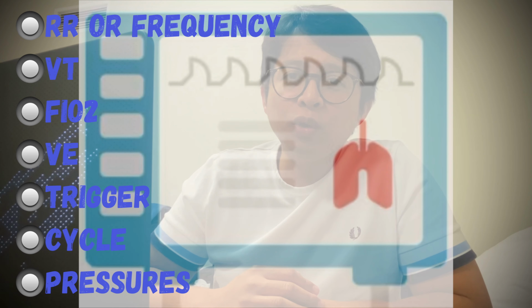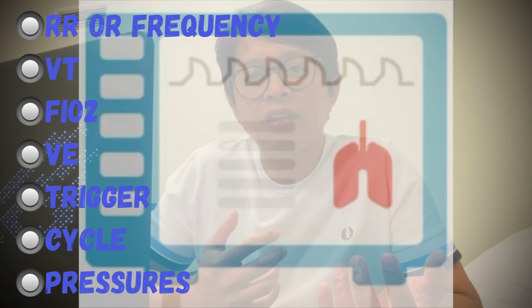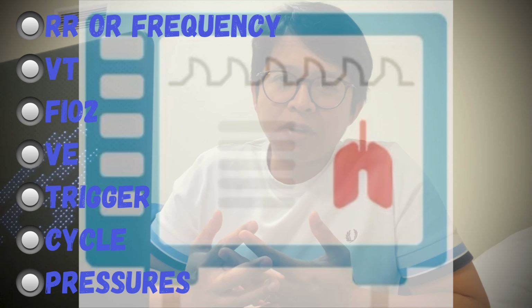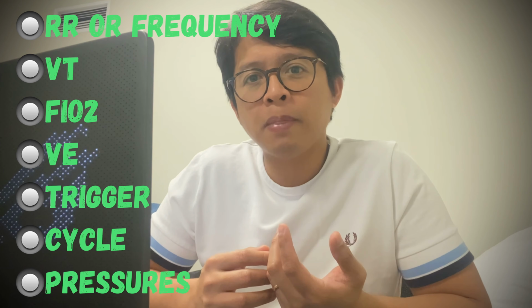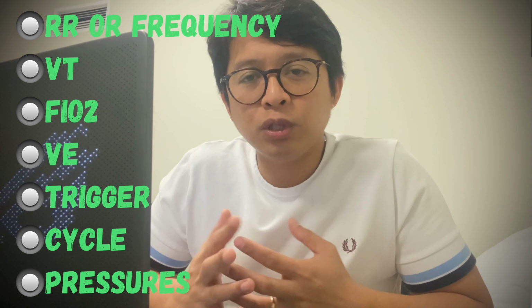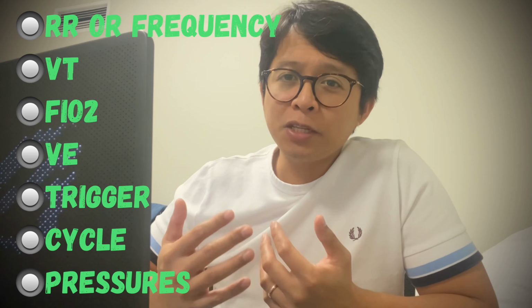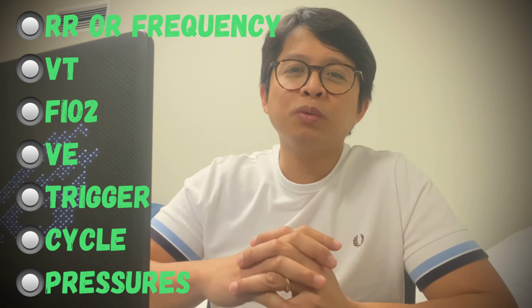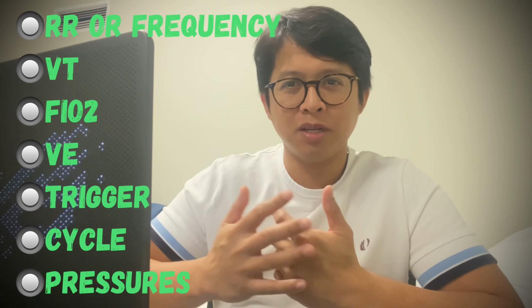Hypoventilation is when you have a low minute ventilation that results in an increased accumulation of carbon dioxide, or PCO2. Hypoventilation or hyperventilation is not decreased or increased respiratory rate or tidal volume alone. So you have to understand how these parameters play along. Got it? There's more about mechanical ventilation that we cannot grasp in one go without going to the university or taking a respiratory therapy course.